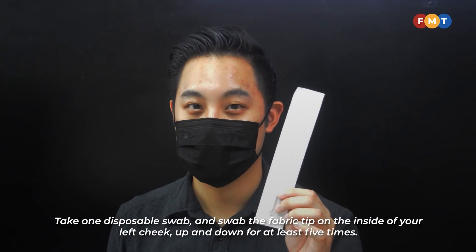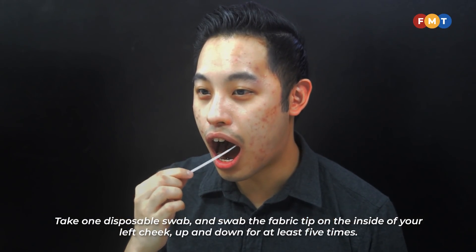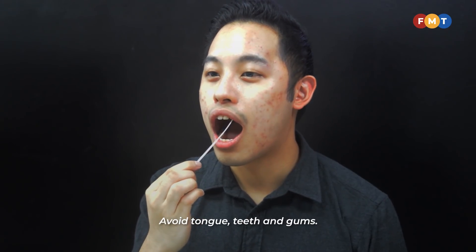Take one disposable swab and swab the fabric tip on the inside of your left cheek, up and down for at least five times. Repeat this for your right cheek and palate. Avoid the tongue, teeth, and gums.